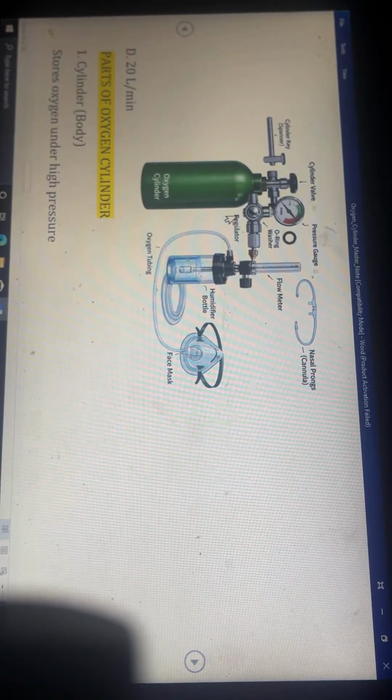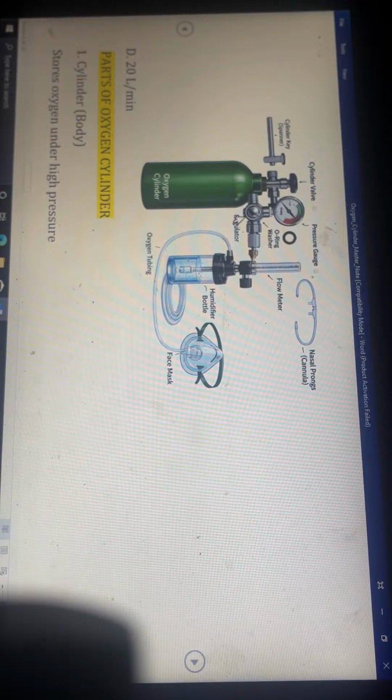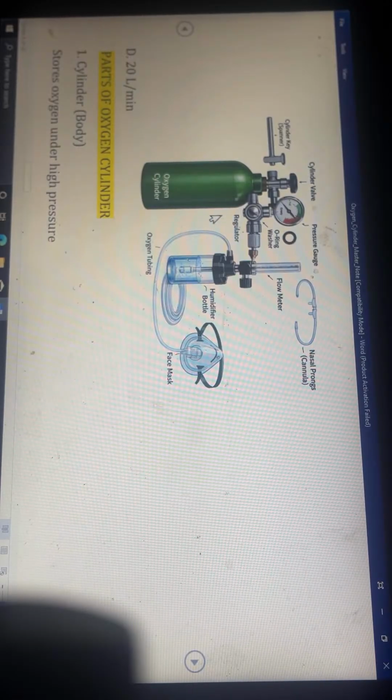Pressure. So we take the word pressure, R. For regulator, we take R. So regulator, REGU. We circle the word R, we write pressure under it, we circle PR. So whenever you see regulator, the first thing you should remember is what Nosbury said: pressure. Whenever you see flow meter, we remember our Nosbury shortcut called liter per minute.